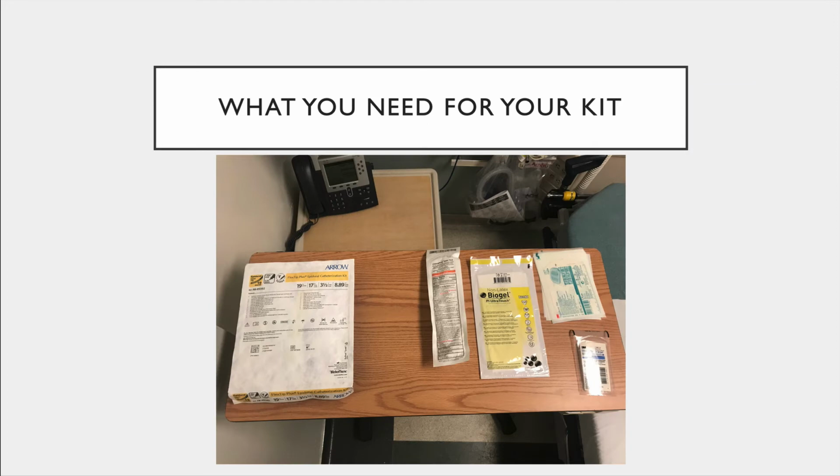So this is a close-up picture of the bedside table. What exactly you need for your kit. You have the Arrow kit itself, you have some chlorhexidine, sterile gloves for your size. You need about 4 to 5 of these larger size Tegaderms and 1 set of these steri-strips.